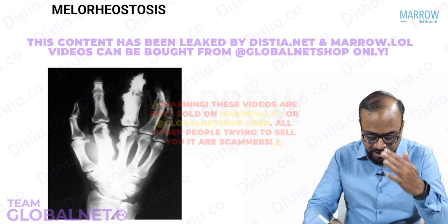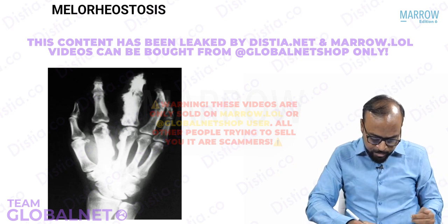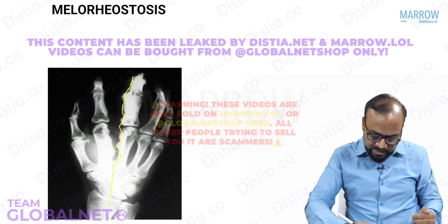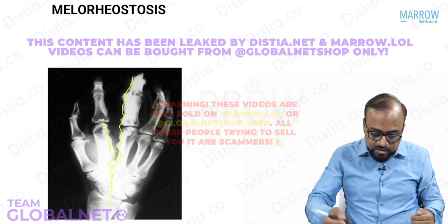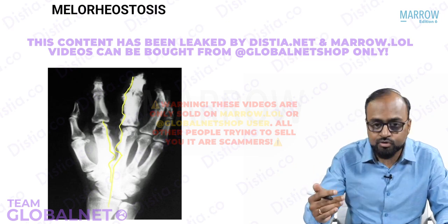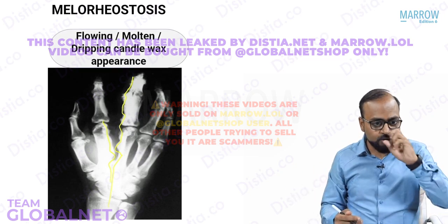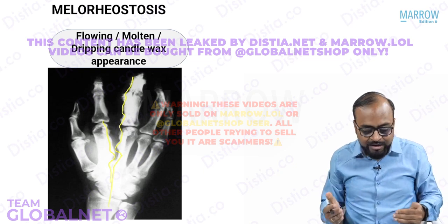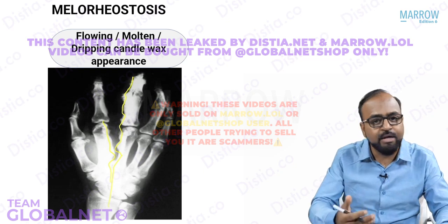But when such flowing hyperostosis, as you can see here, is seen along one side of a limb, along the bones, can you see this dense reaction which is happening? So this is what is called melorheostosis, and this flowing hyperostosis is given a name. This is the flowing candle wax, molten candle wax, or dripping candle wax kind of appearance of melorheostosis.